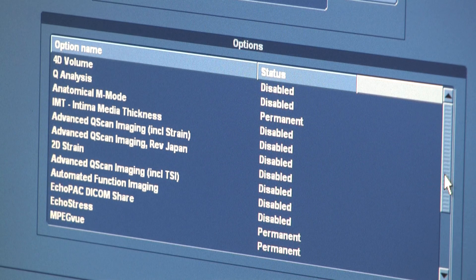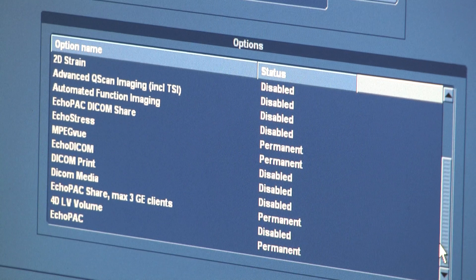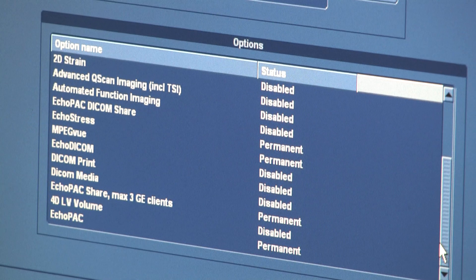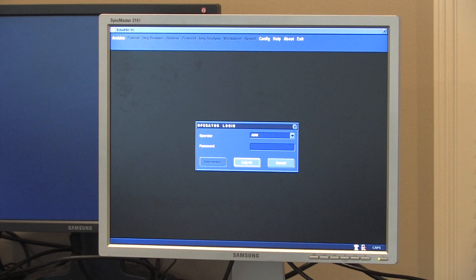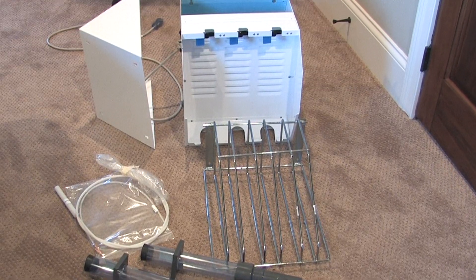The Vivid Eye and the Echo Pack workstation were previously connected through a network, so there is a DICOM listener on the workstation for that. There is also an extra monitor that comes with it, and a TEE cleaner.